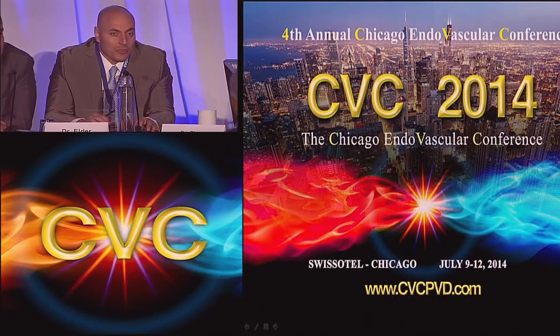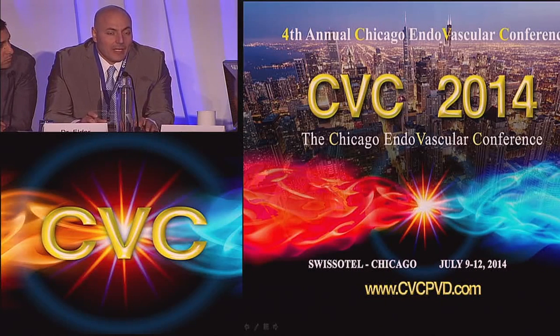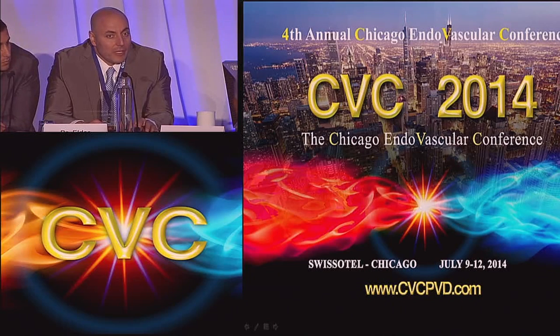So, I never use any supplemental TPA afterwards. A few times when we use the ECOS, so there's a little bit more clot burden, you can just extend the time. I typically use it for about 15 to 17 hours, and I'll extend it for an extra 5 to 6 hours. And I'm not sure if the panel does it differently, but I tend not to use any supplemental TPA afterwards. Well, that's what I meant, if you leave the catheter.